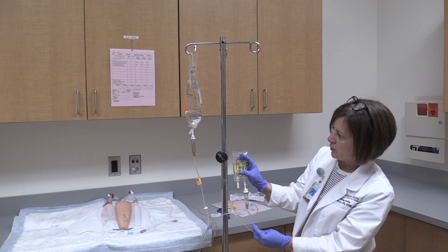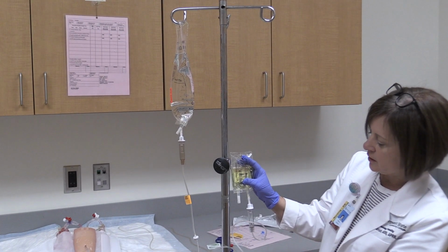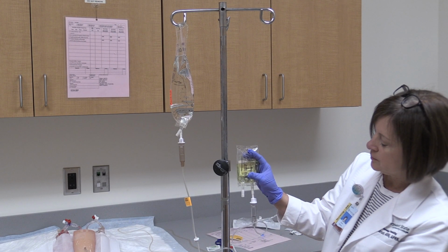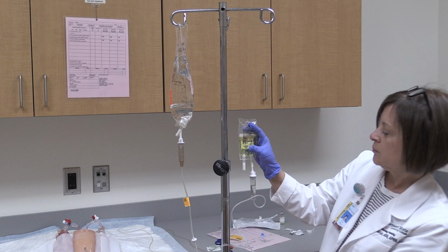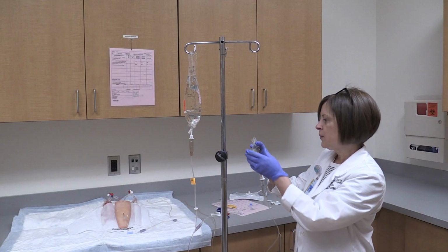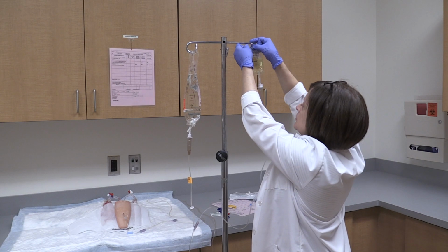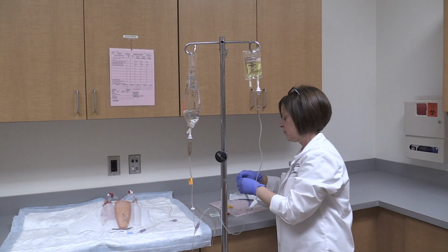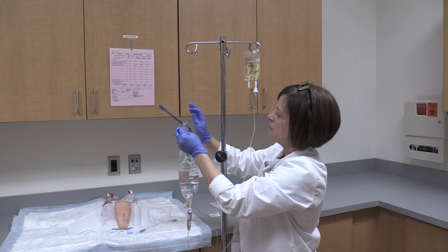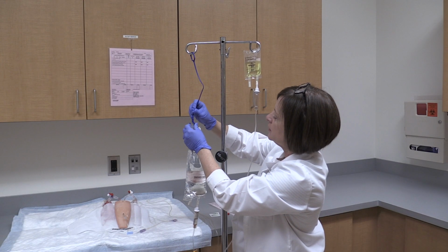So as long as it's lower, you can see that it's dripping from the primary, starting to fill the line here. And I'm going to fill my drip chamber about half to 2/3 full. That looks good. And then I immediately reclamp it. This time I can hang my secondary up here. And because we want the secondary to infuse now, we need to lower the primary. So we'll hook that onto our hanger.